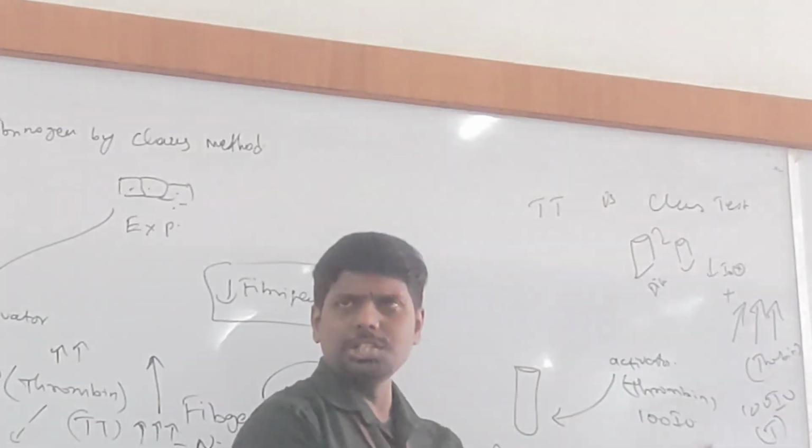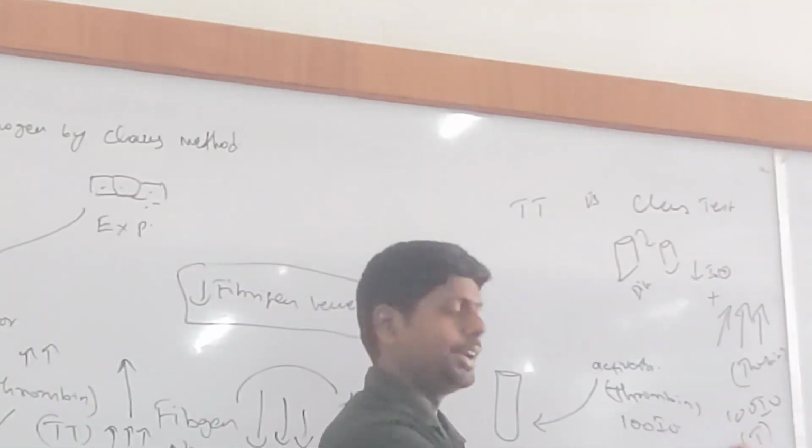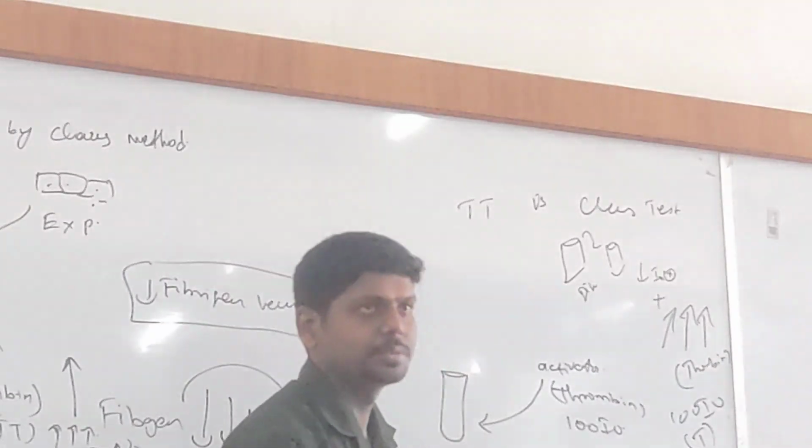After addition of thrombin, what will we do? We will measure the time it takes, the thrombin time. That's it.